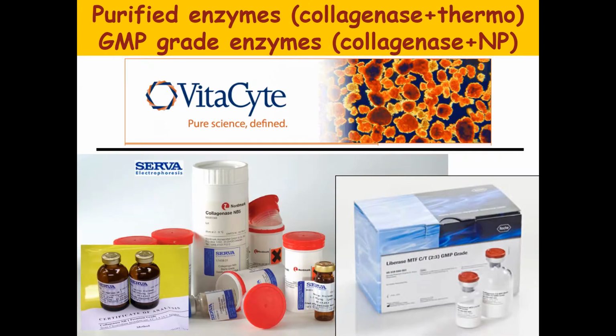These are the 3 commercially available collagenase enzymes. Each company supplies collagenase and protease in different combinations. For example, the company Roche supplies collagenase in combination with thermolysin. The Serva enzyme company supplies collagenase and Clostridium histolyticum neutral protease instead of thermolysin. And then the company Vitacyte supplies collagenase and BP protease.